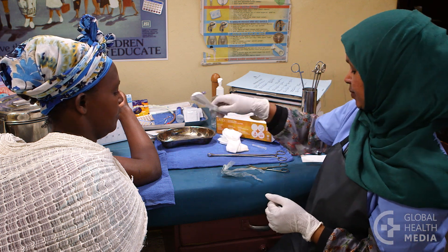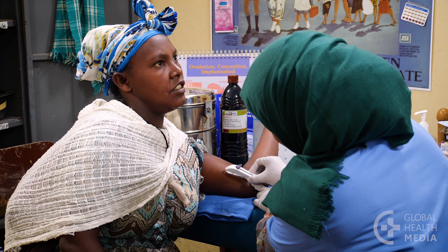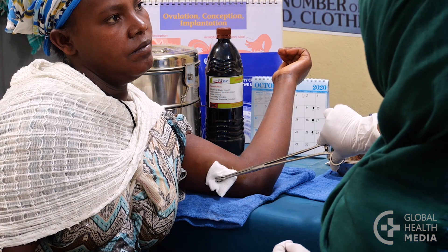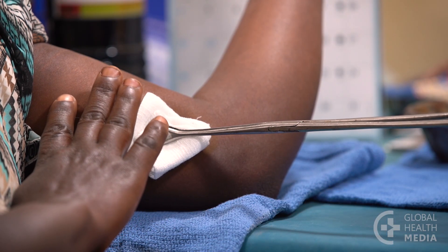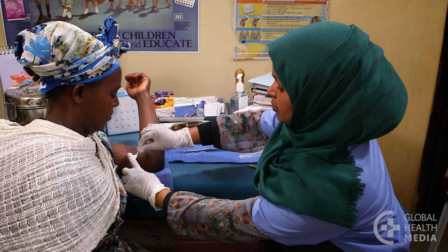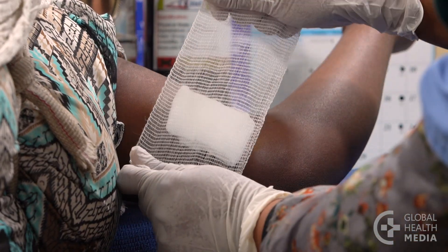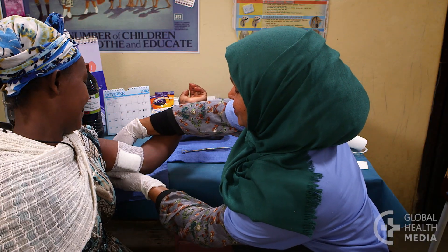Then, using a special device, she'll insert the rod just below the skin. She'll ask you to feel the rod, then apply adhesive tape and a bandage on top. The whole procedure takes only a few minutes.